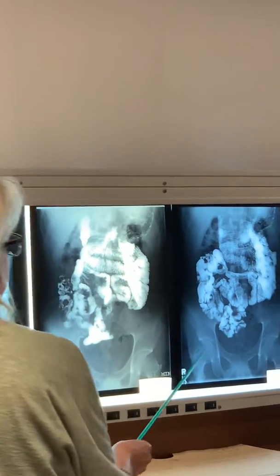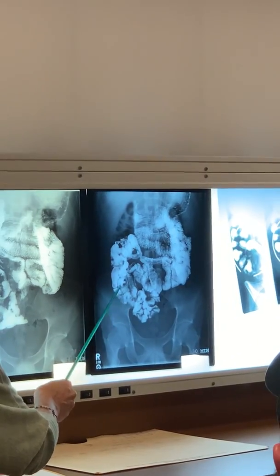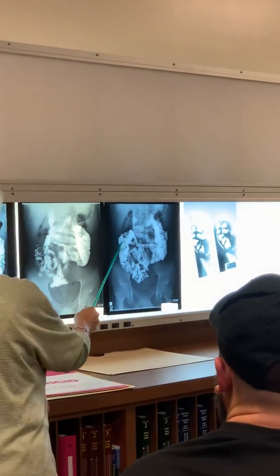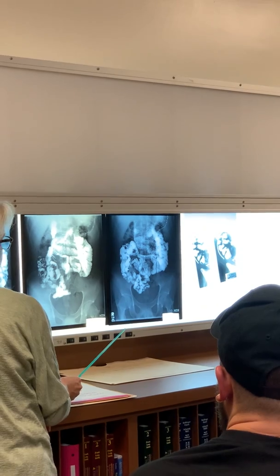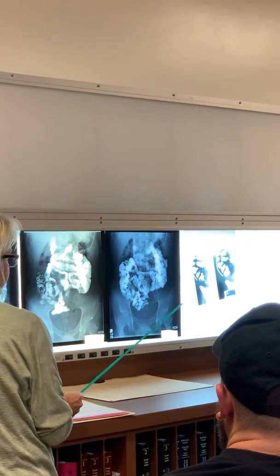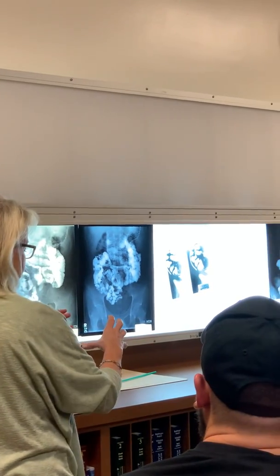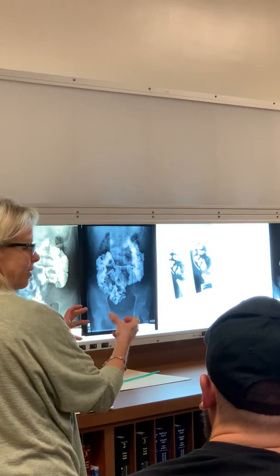This was an easy one. Okay, all done. They come over here, and it's already in the cecum here. So basically the study's done. Some places do what they call spot the TI, spot the terminal ileum, and they use that little paddle looking thing.